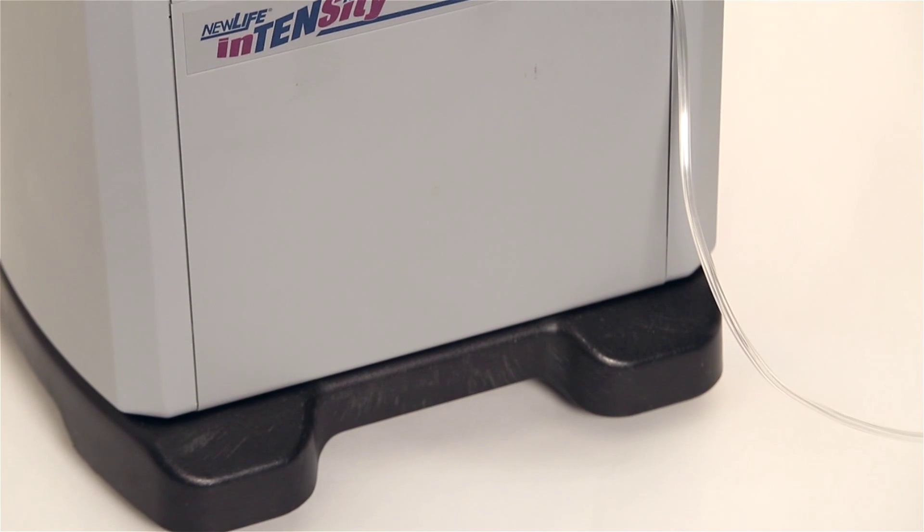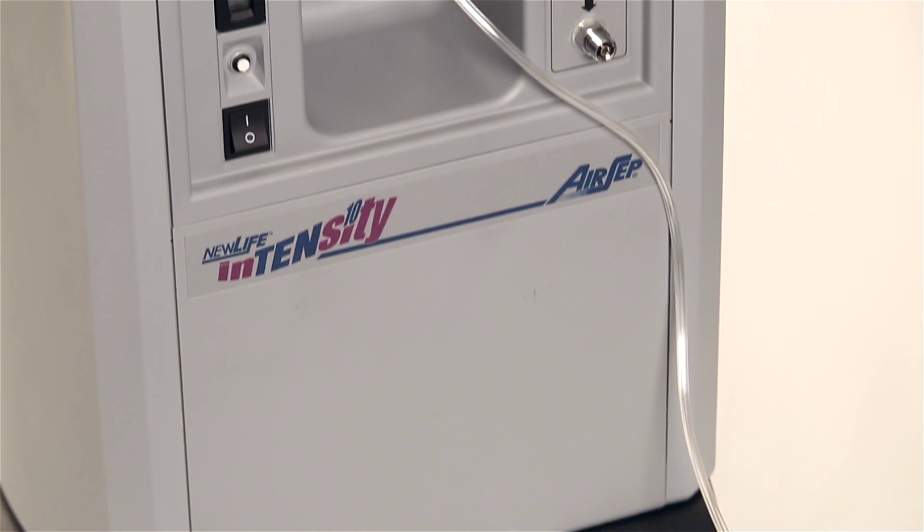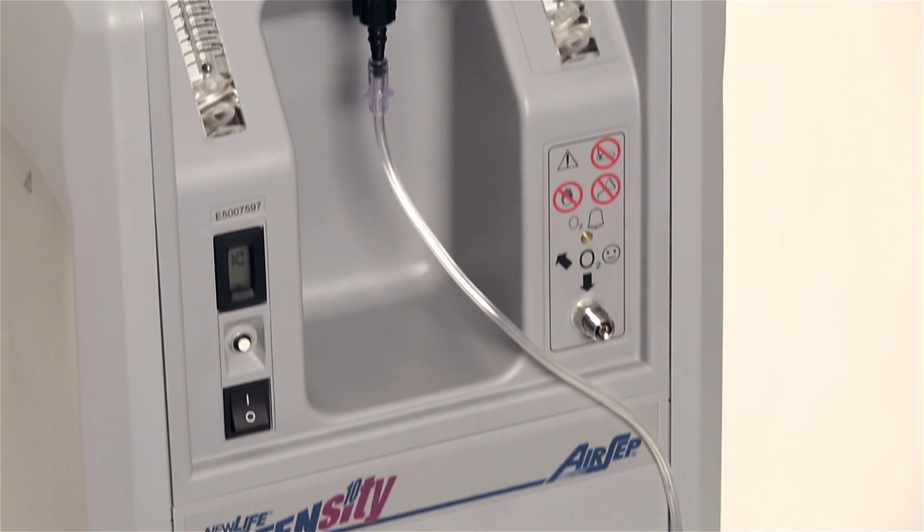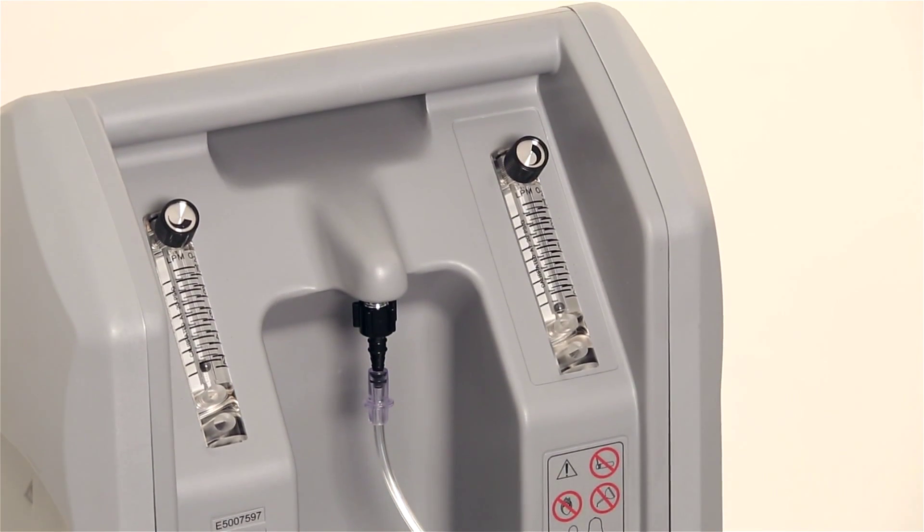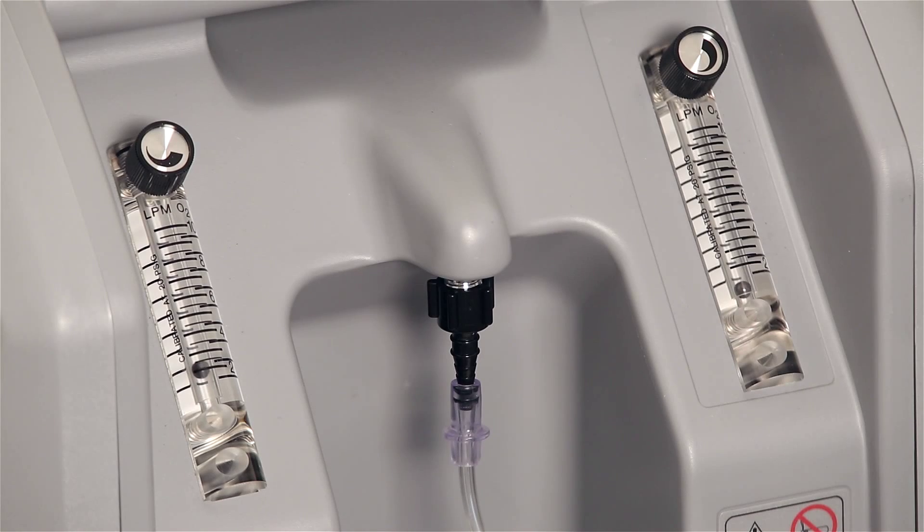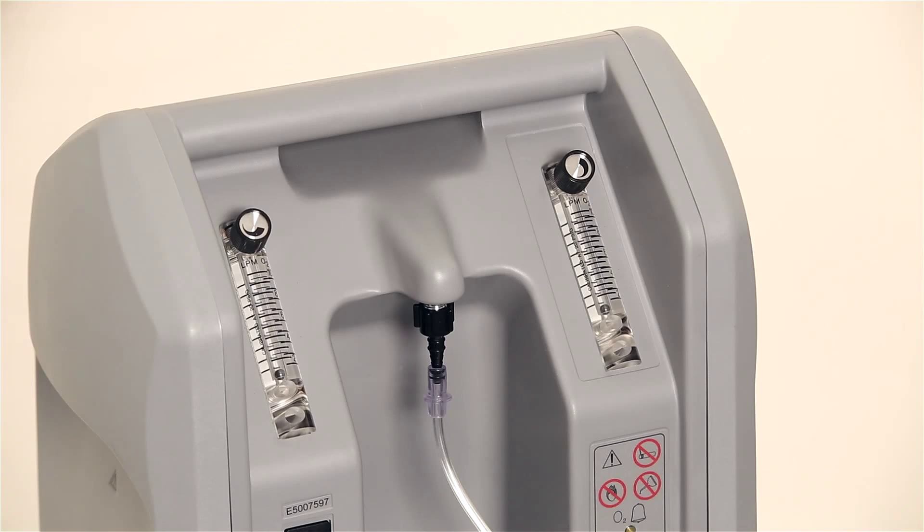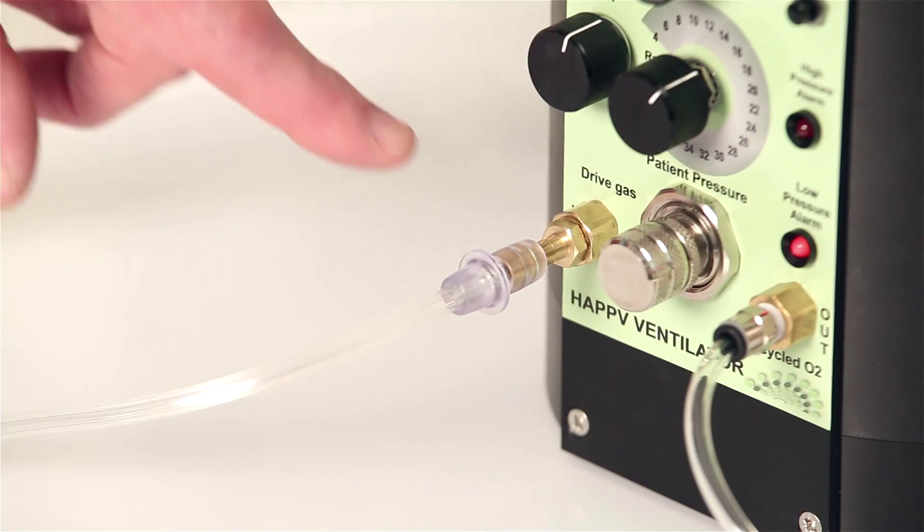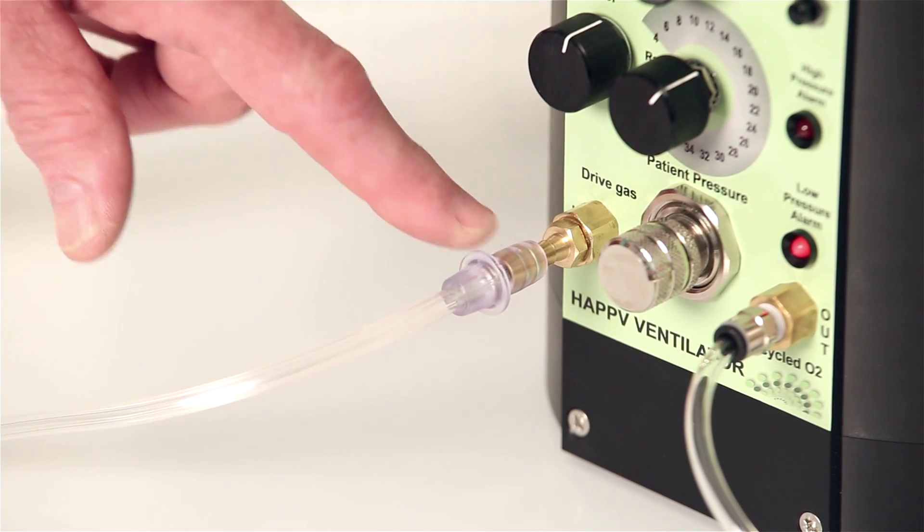The ventilator can be driven by any gas supply from 1.5 bar 20 psi to 5 bar 75 psi. If a suitable oxygen concentrator is used, the drive gas tube can simply be connected directly from the concentrator outlet to the drive gas inlet on the ventilator.